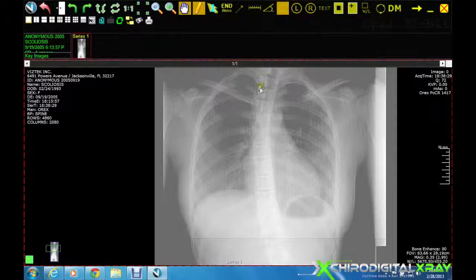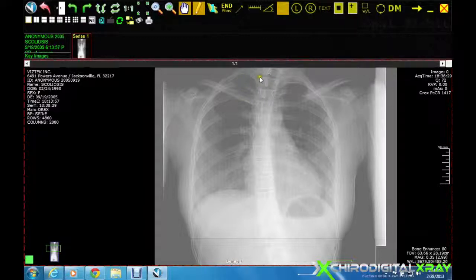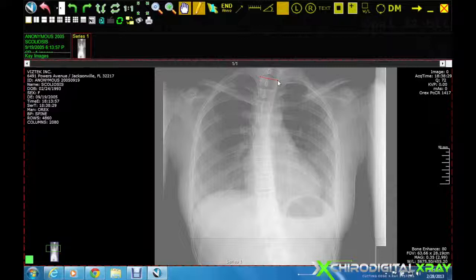Then click on the left aspect of the superior endplate of the most superior vertebra that contributes to the scoliosis. Then click on the right aspect of that same endplate.